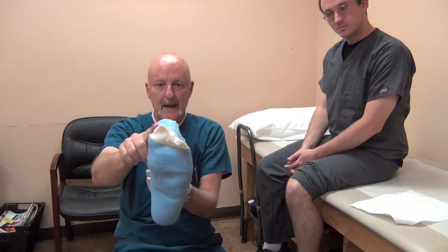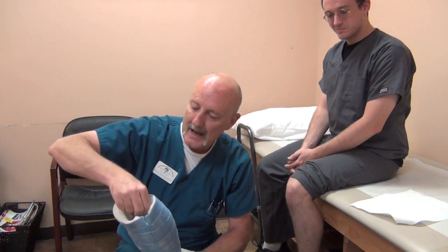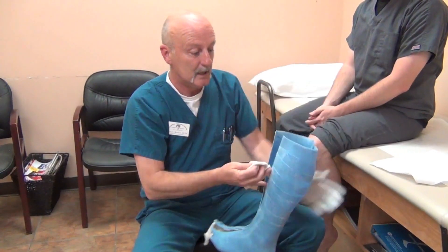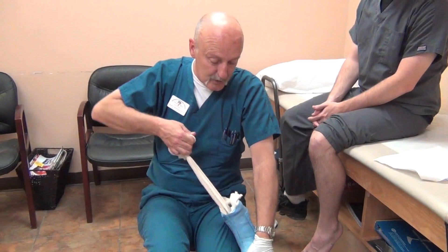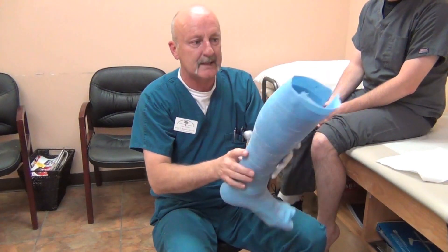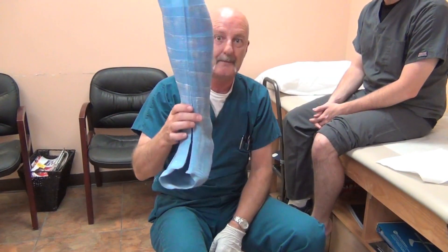I also know that I've got the right amount of toe-out. Now, before this sets up — if you're going to use us for central fab, please remove the stockinette, and do that while it's still wet. It comes out very easy. Not too wet, because it will distort your cast — just before it gets fully hard and gets really bonded in there.